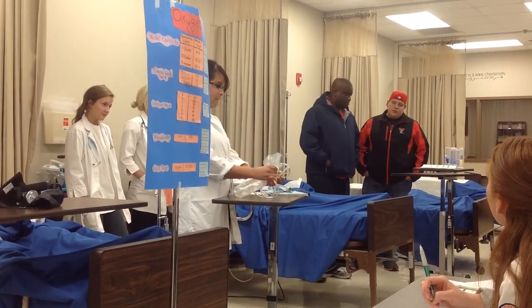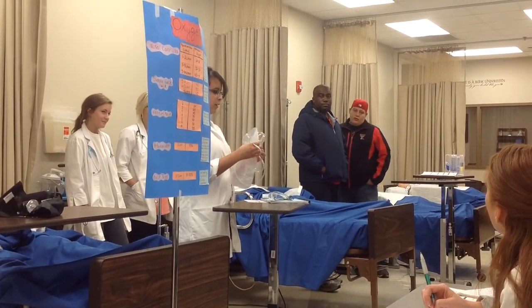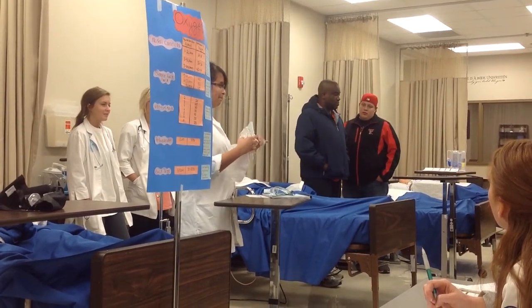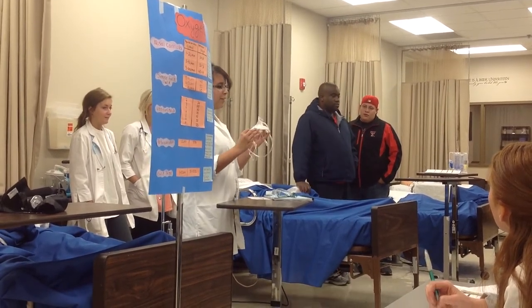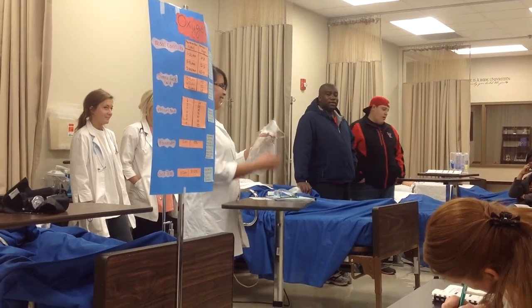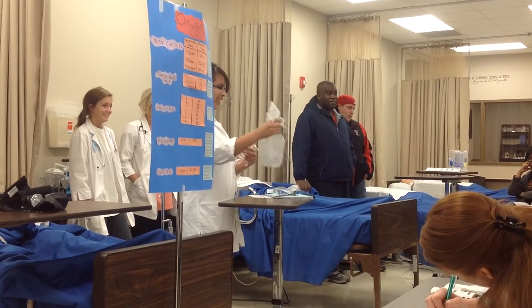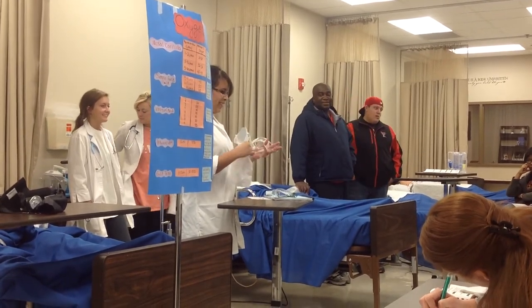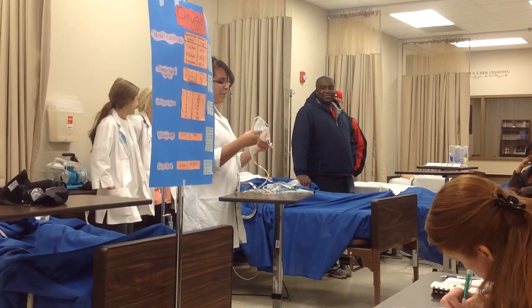And you must remove this to eat. You want to make sure that it stays 3/4 full. The bag has to stay 3/4 full. And it gives you that 70% oxygen. At 10 liters per minute, it gives you 70% oxygen.